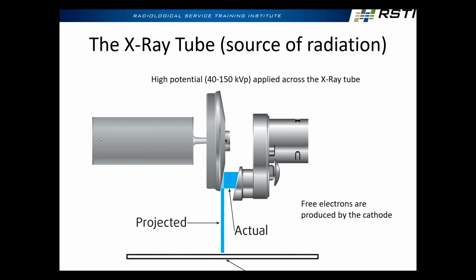But we're talking about some pretty high voltages here. One of the reasons that our system is as insulated as it is, is that 150 kV, in case you didn't know, will arc through 4 feet of air. So that'll reach out and touch someone. So yeah, we want to treat it with respect. Also, when we get inside of some of these cabinets, you're looking at somewhere in the 400 to 800 volt DC range for a lot of these power supplies on the primary side. So they mean business, right?